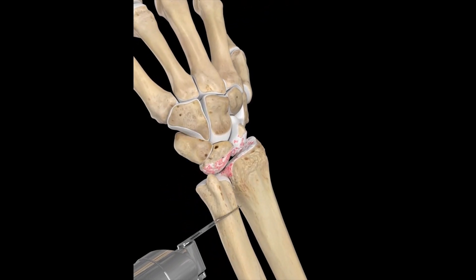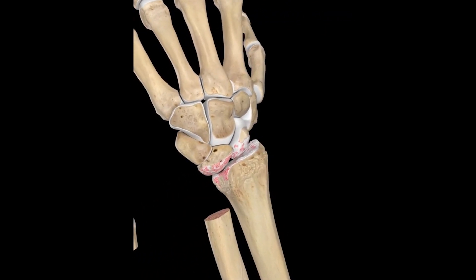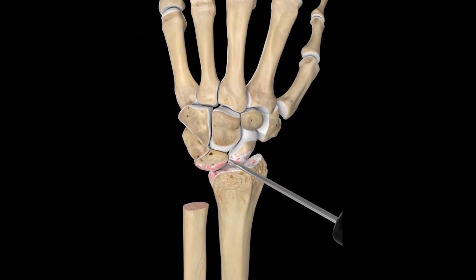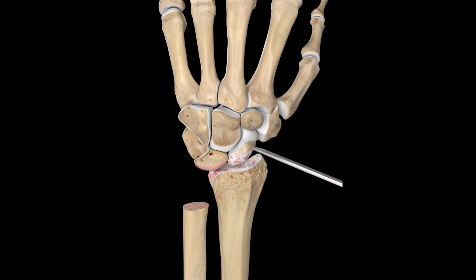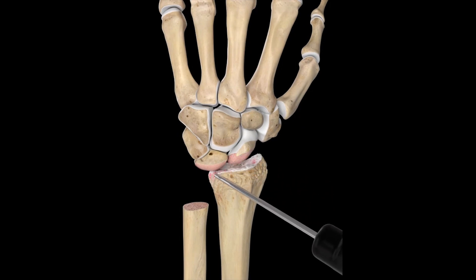The distal radial ulnar joint is the distal joint between the radius and the ulnar bone. Replacement of the distal radial ulnar joint following ulnar head resection is a procedure used in patients suffering from rheumatoid or post-traumatic arthritis.